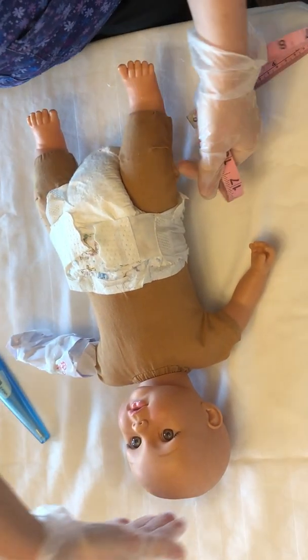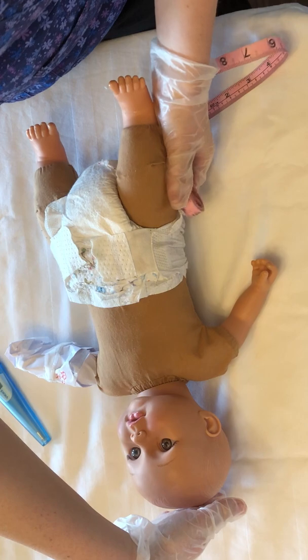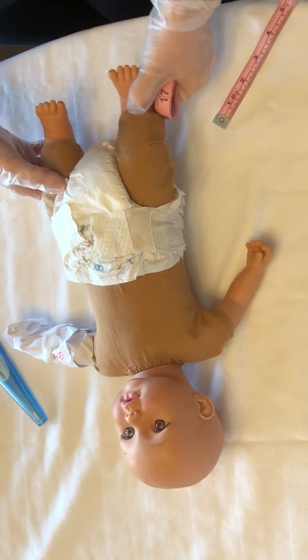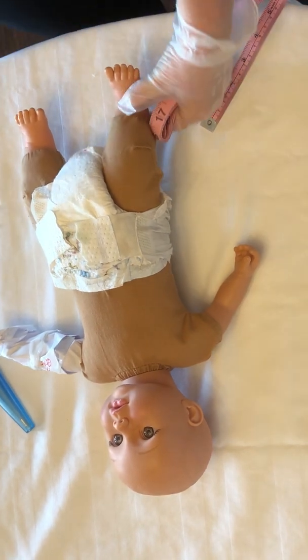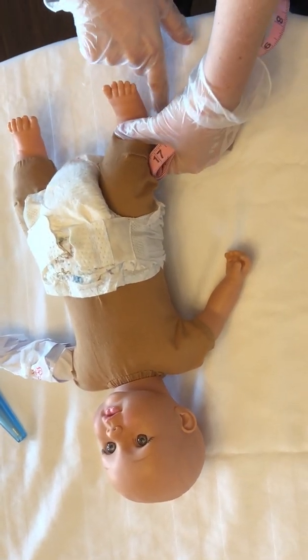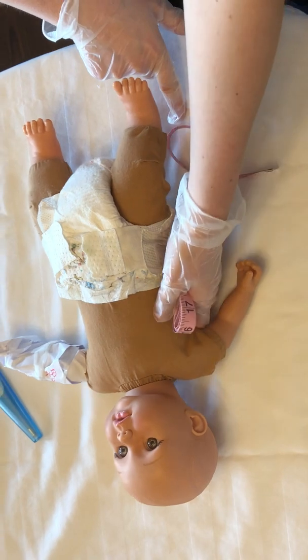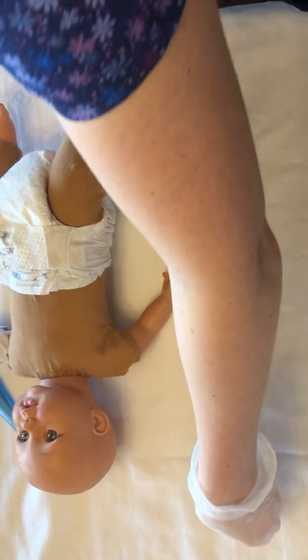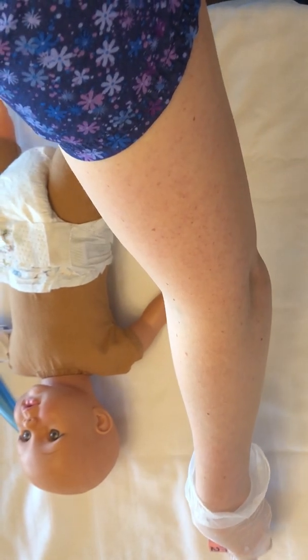And you want to measure the baby's length. So to do that, you want to put the baby up against the edge of the bassinet that it's in, and then you want to get them to straighten their leg. And then using a pen or a marker, you can make a mark when the baby's leg is straight about how long the baby is, and then you measure that to the edge of the bassinet.